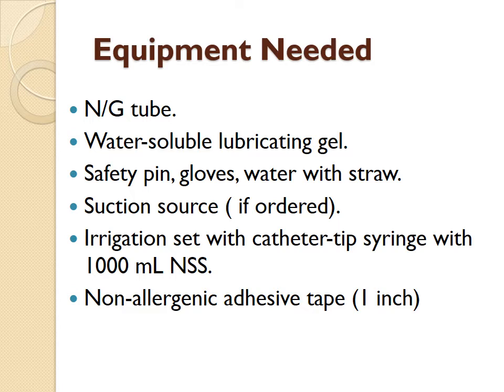Some nurses do not use it to insert the tube. Others do, depending upon your preference and the patient's preference. It does help if you have a cup with water in it and a straw for the patient to take when you're starting to advance past the oropharynx area, because then the patient, first of all, is concentrating on swallowing, and secondly, the swallowing allows for easy advancement of the tube. Again, though, it's a preference.